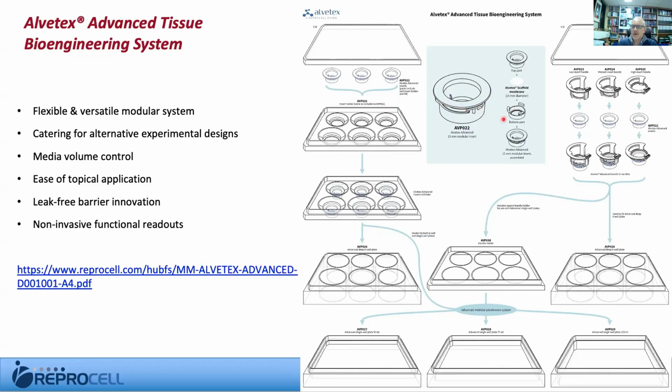And that cup then can be placed in these handle holders, and they can then be suspended into trays or individual wells in a multi-well plate, or these inserts can be placed into another holder, which is a 6-station version, which holds all 6 models together, and that can also sit in a plate or a single well tray.